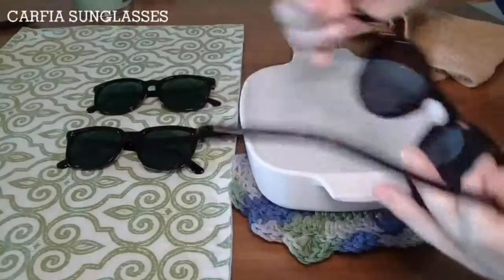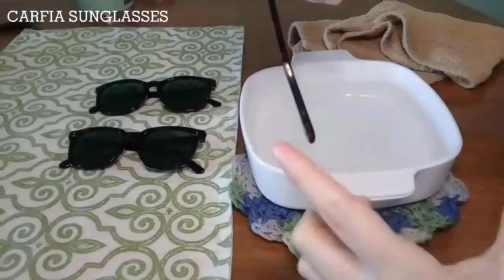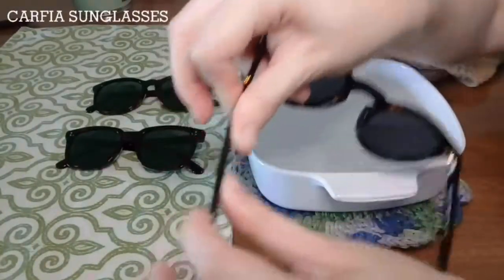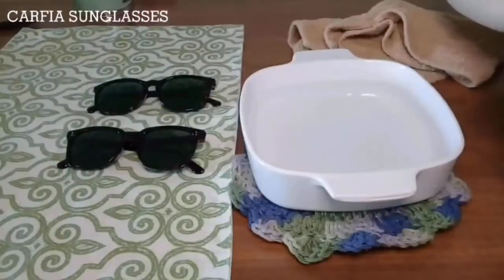If you find that it has made the temples, how they curve where they meet, closer together and tighter, then like I said, just follow that tip where you keep pushing and making that bend as you go all the way down the temple, and it will widen it down there for you.